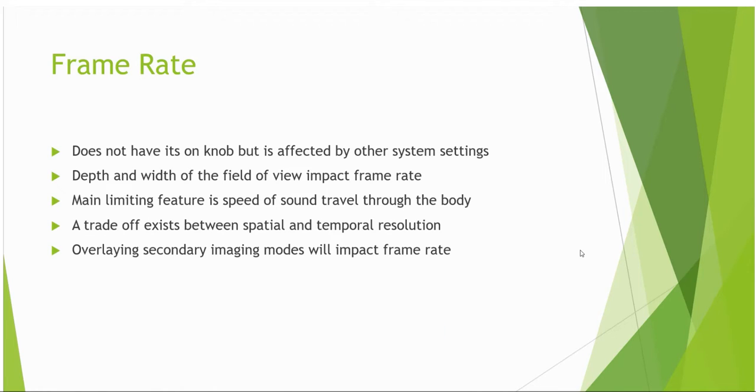Most machines these days can attain frame rates above 30 Hz in all modalities for 2D imaging. The system will often cap at 30 Hz to reduce data storage, so anything above this is acceptable. Problems occur when we image very deep into the patient or apply features such as color Doppler. In these instances, we should reduce the 2D field view size, reduce the size of the color box, or apply a zoom box, in combination or in isolation so the desired effects are achieved.